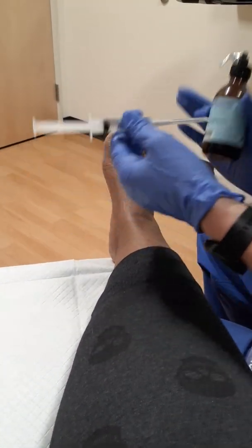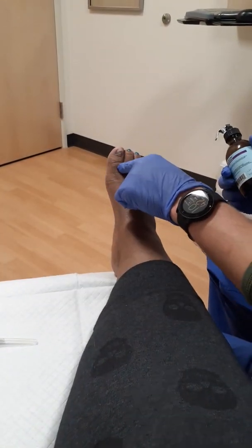All right, first step is just going to be two little shots here and here, okay? This is probably the worst part of the whole thing because this is the part that hurts. After this, we get you numbed up and you're all numb from there, okay? So it's just going to be a shot here and a shot there, okay? Like I said, this is the worst part.